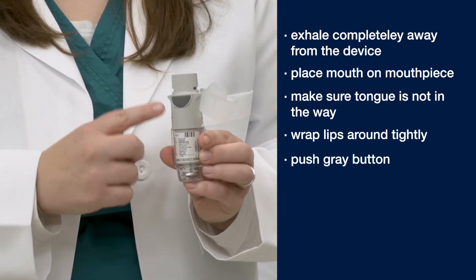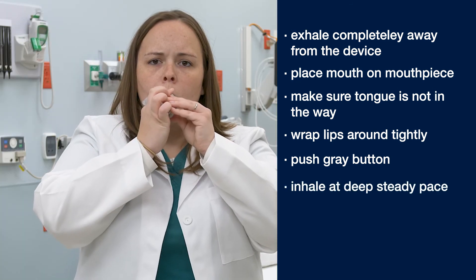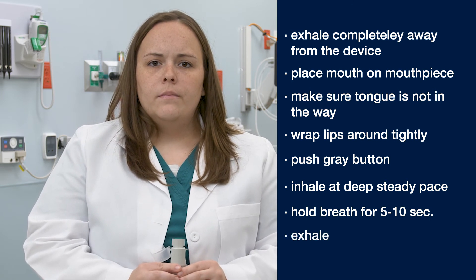You will want to push the gray button on the side of the Respimat as you take a deep steady breath in. You will then hold your breath for five to ten seconds before exhaling away from the device.